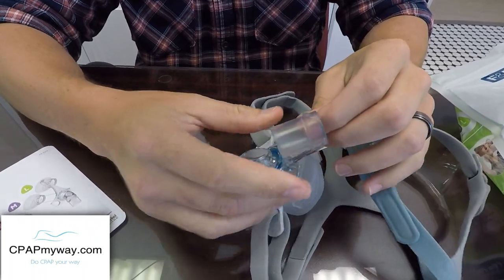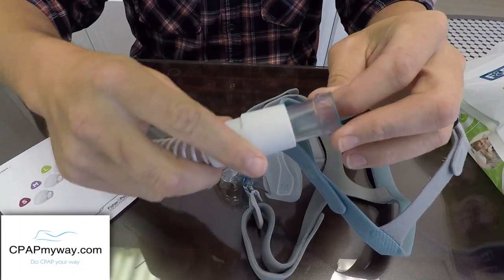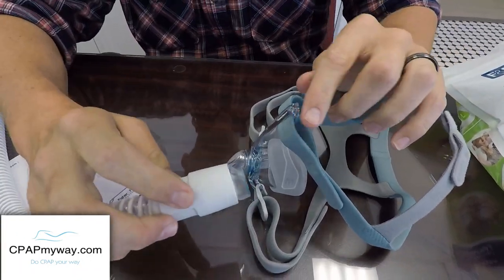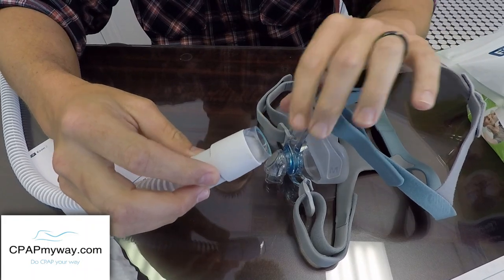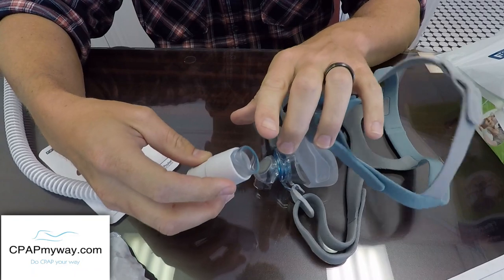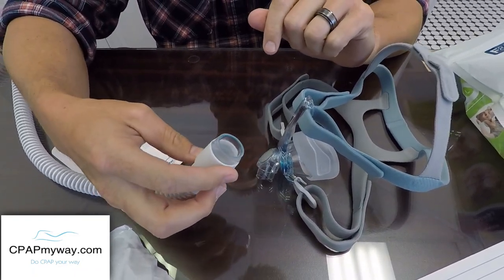The other thing I do want to point out while I'm looking at it here is this is a quick connect. I'm going to go ahead and install it in the end of this tube so you can see it. This is one of those masks where it's very easy to forget that you have a quick connect on. So if you're switching to this mask or from this mask, check the end of your tube and make sure that you don't have a quick connect stuck in there. It's great for quickly attaching to your CPAP, but a lot of times people forget it's in there when they're switching to a new mask or getting a replacement mask.